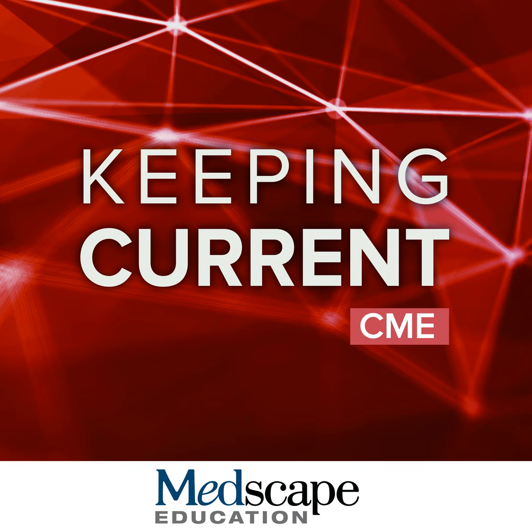And this may be the most important slide that I'm giving you in that if there's a problem with the cerebellum, then you can get the wrong number for your Centiloid. So what do I mean by that? If you're dividing by the cerebellum, but the patient had a stroke in the cerebellum, or they didn't scan the whole thing, you can actually get a false positive Centiloid scale. On the other hand, we know that in patients with advanced Alzheimer's disease, there is actually plaque deposition even in the cerebellum. In that case, you're going to get a false negative or low result on the Centiloid scale.